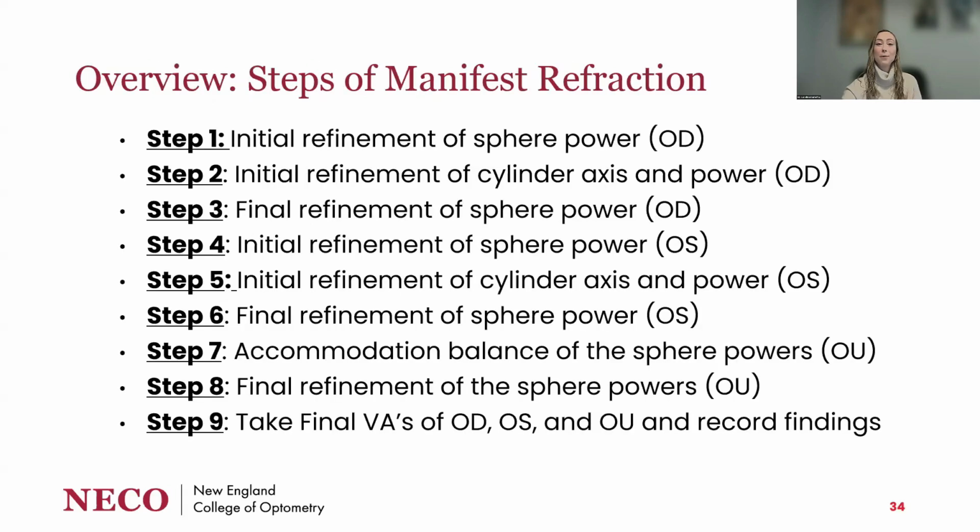This is an overview of the steps of manifest refraction, and we'll go through them one by one, keeping in mind for this lecture, we will be talking about minus cylinder.